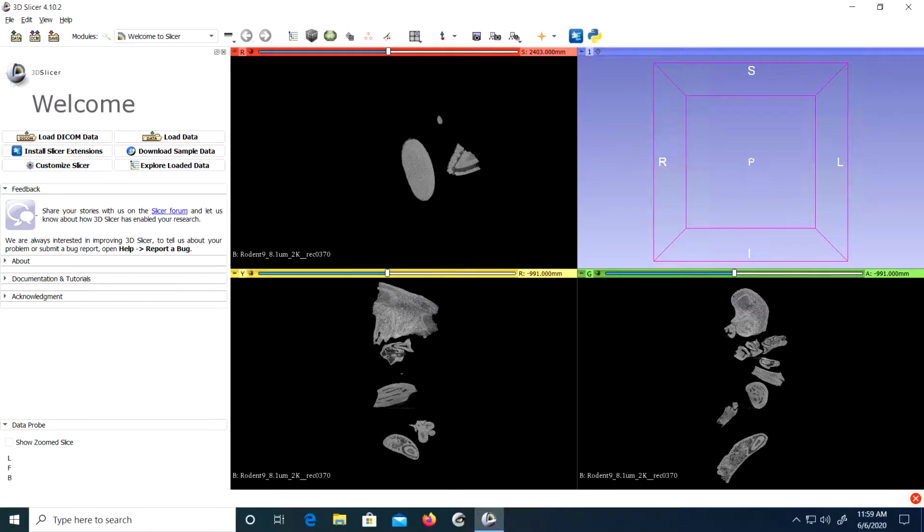Although there are many different image formats for volumes, I highly recommend saving any volume you load in as an NRRD. Depending on the type of volume you loaded in, this may require some different conversion steps. I'll be touching on the ones required for an image stack, which is what you'll typically run into.